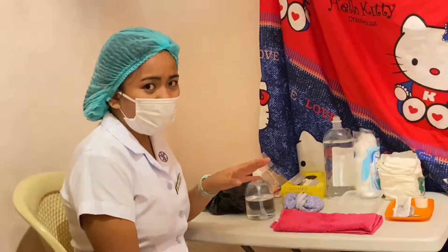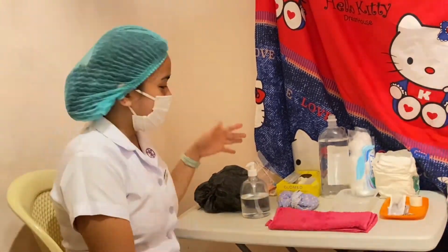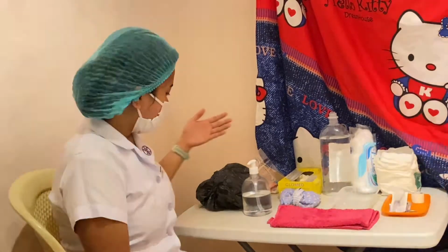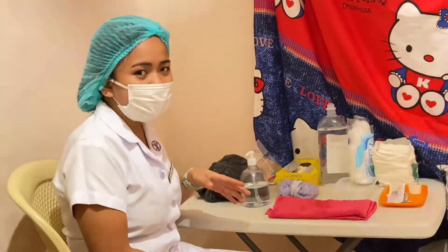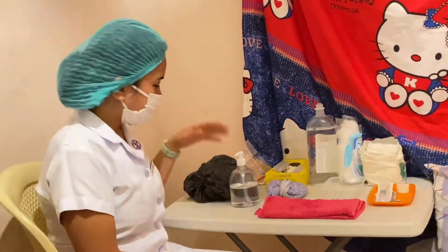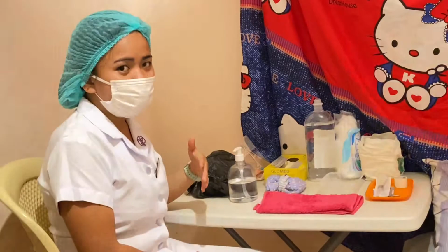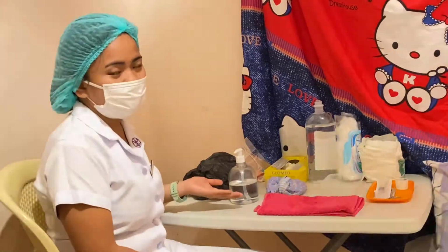If splashing of fluids is anticipated, a set of personal protective equipment should be prepared. So, here it is: disposable gloves, face shield, a trash bin, or if in the hospital setting, you can see a yellow trash bin, meaning a hazardous bin, an apron to protect ourselves as healthcare professionals during the wound dressing, and of course, alcohol for hand hygiene.